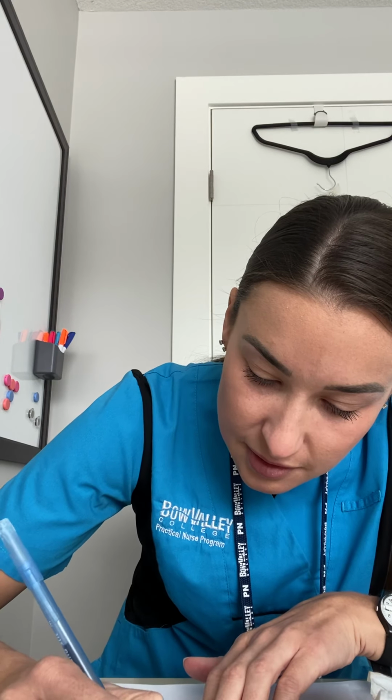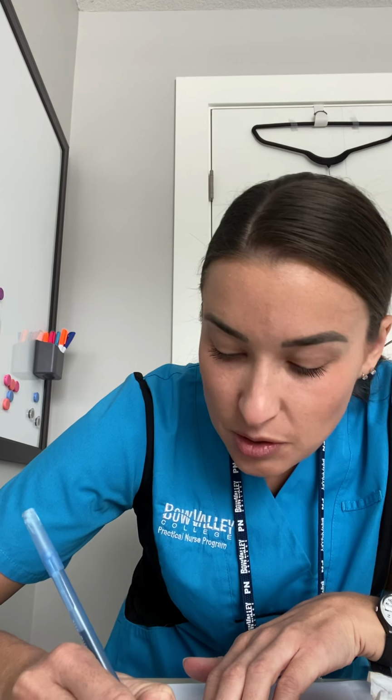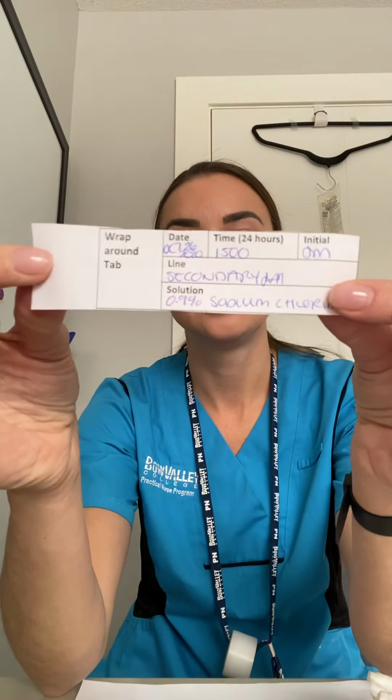Secondary, and sorry, and the solution is 0.9% sodium chloride. There we are. Okay, so now that we have all of our things, what we want to bring in is tape, ID, secondary line, IV piggyback with medication, secondary line label, MAR, and doctor's orders.